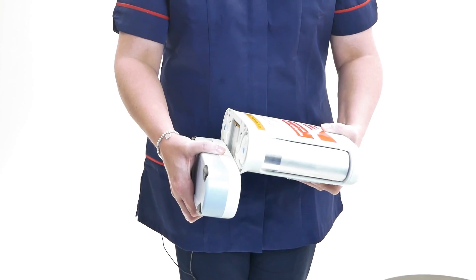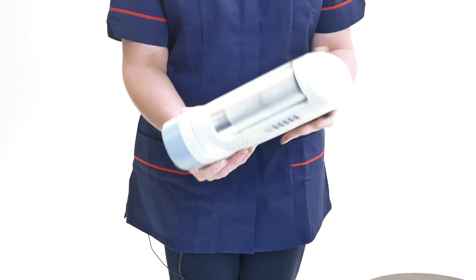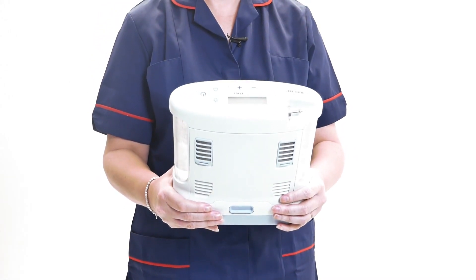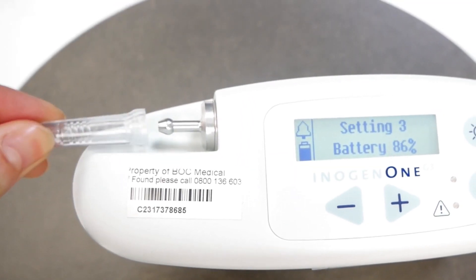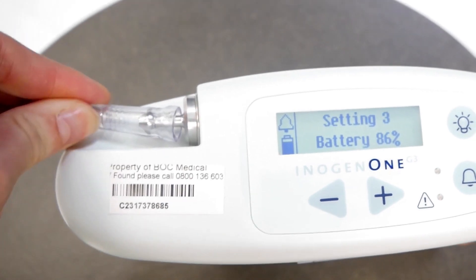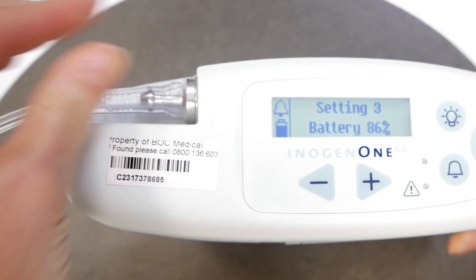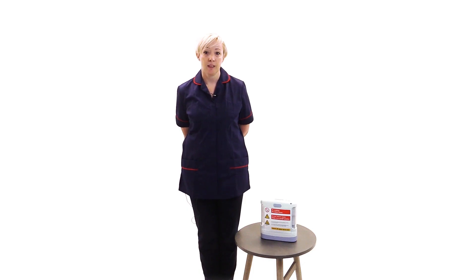To operate the device via its detachable battery, install the battery by sliding it in place at the bottom of the device until an audible click is heard and the battery latch returns to the upper position. Connect your nasal cannula by fitting it and ensure that you get a good seal and tight fit between the tubing and oxygen outlet. Turn on the device by pressing the on-off button; a single short bleep will sound.